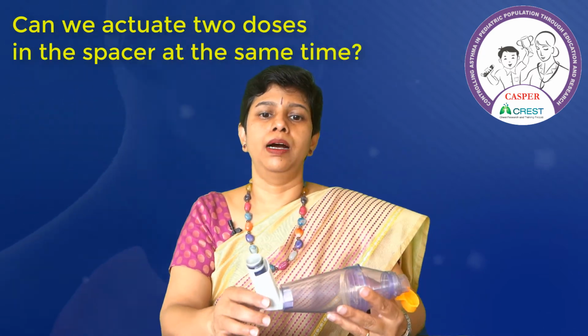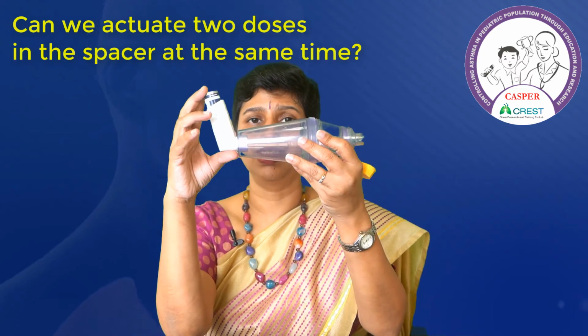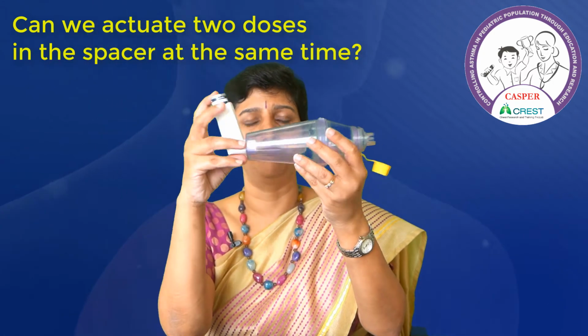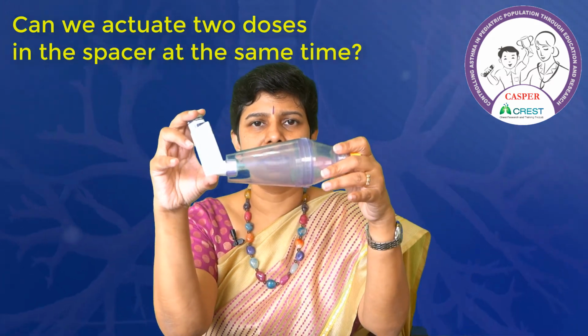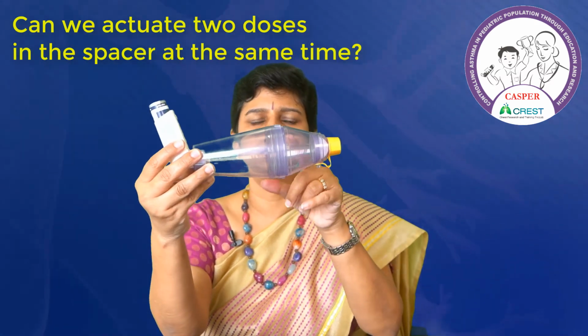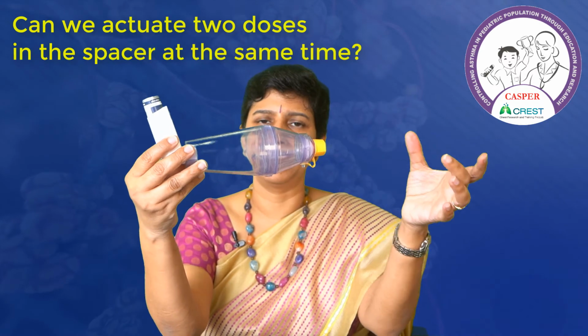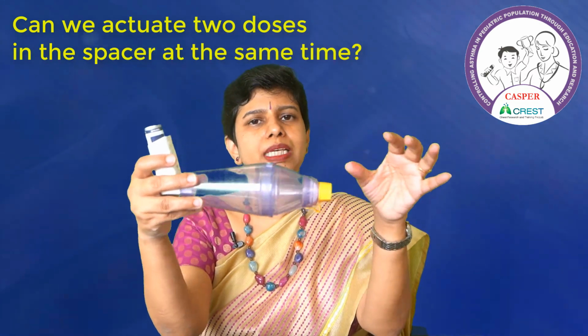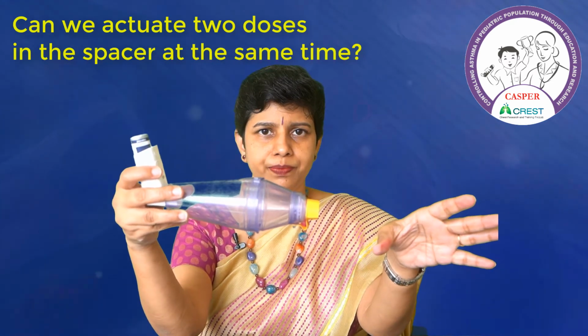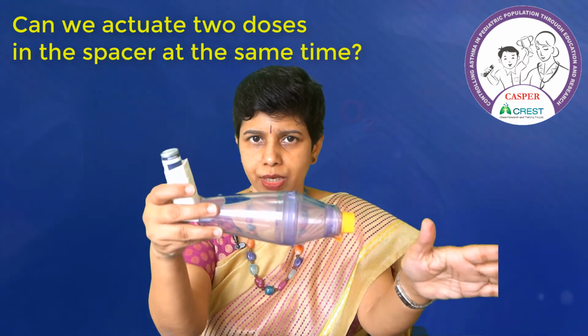Okay. Can we actuate 2 doses in the spacer at the same time? Remember that when we actuate 1 dose, it is available in the spacer and available for inhalation. But if we actuate 2 doses at the same time, the second dose is just a waste. So we are just wasting the drug.